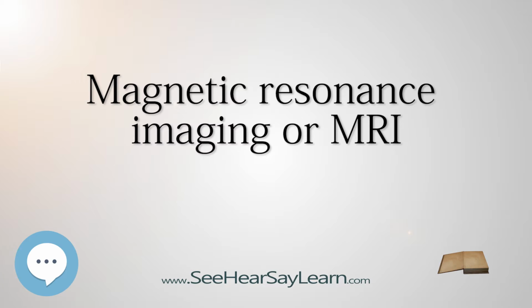MR imaging provides a three-dimensional view of the target tissue, allowing for precise focusing of ultrasound energy. The MR imaging provides quantitative, real-time, thermal images of the treated area. This allows the physician to ensure that the temperature generated during each cycle of ultrasound energy is sufficient to cause thermal ablation within the desired tissue, and if not, to adapt the parameters to ensure effective treatment.